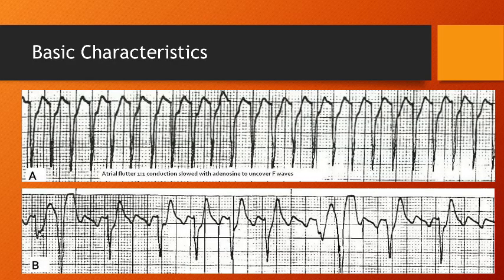Now let's start discussing the important points regarding supraventricular tachycardia. There are different types. Whenever we look at an ECG, we look at the rate, the rhythm, the axis and all these things. We will go through these in the start, and then we will study some of the algorithms that have been defined to identify supraventricular tachycardia and to differentiate it from ventricular tachycardia.